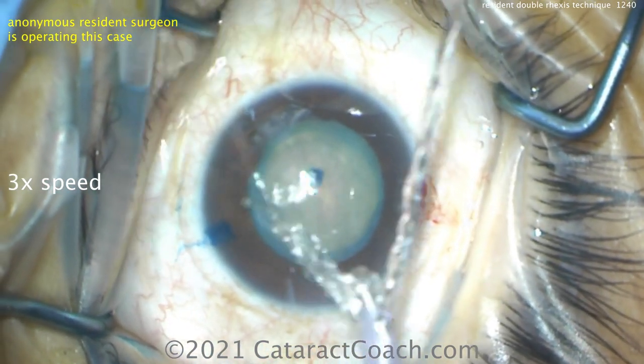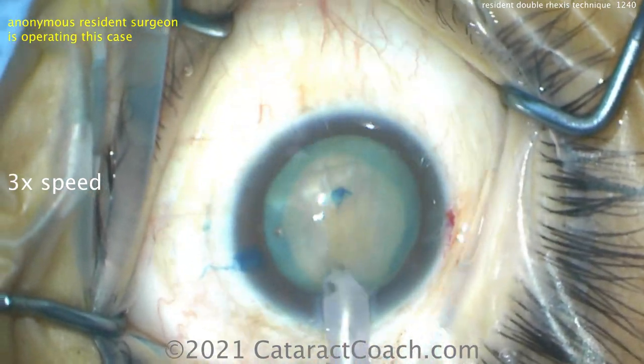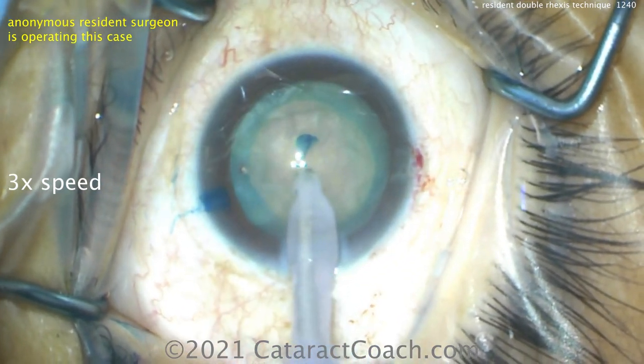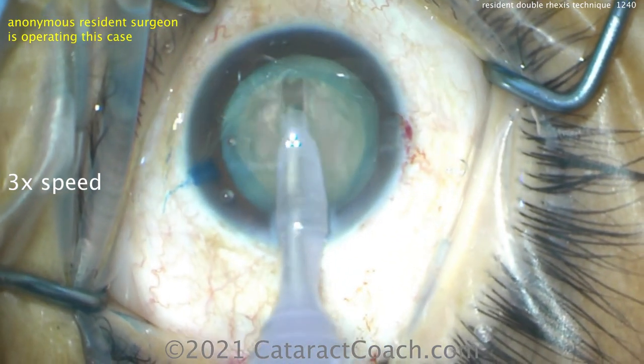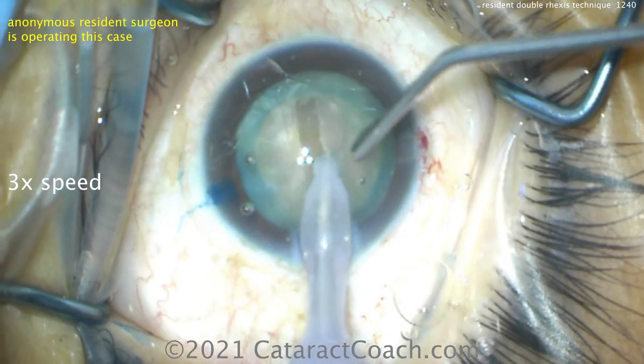So this resident is going to use the phaco probe making a central trench — a groove down the middle — maybe a stop and chop technique. Stop and chop, I think, is a very nice useful technique. It's a great resident thing to learn because then it'll be relatively easy to transition towards straight chop or quick chop.